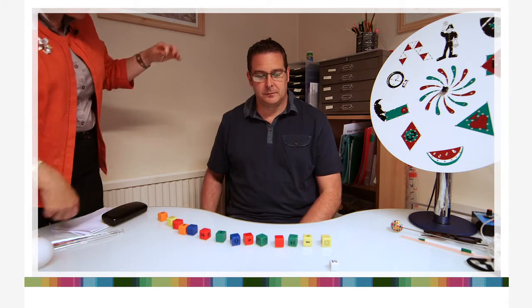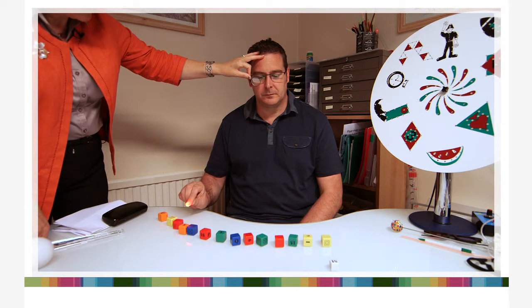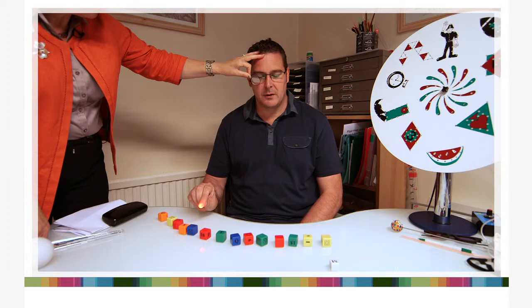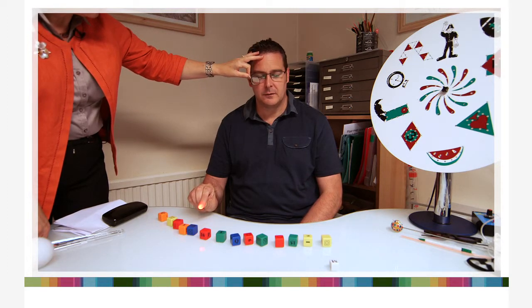Take your finger out into the blind area. Take it right out to the side. Okay. Here comes your extra prism. There. Yeah. Don't move it. I want to get my brain working. Yeah. And if I take this away, you can't see it now? No. And you can now? Yeah. So it does widen it by, what, a couple of bricks, isn't it, really?